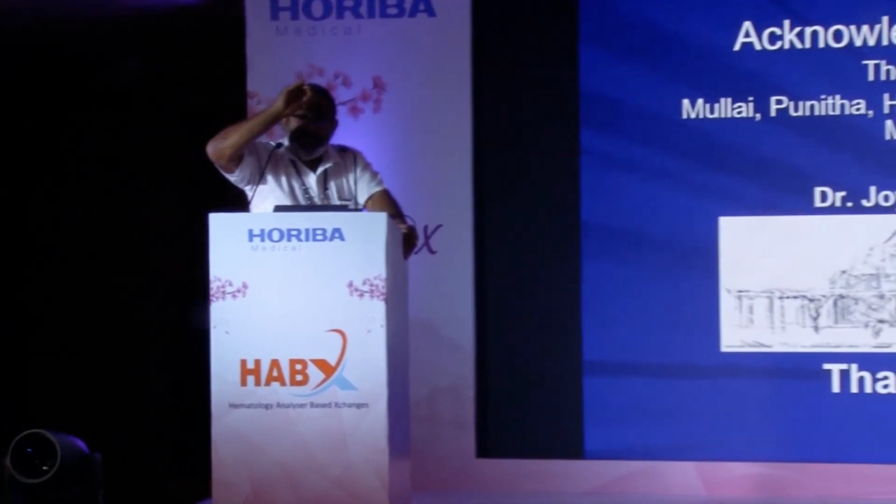Oh my God, actually, madam! I'll tell you one thing. NRBC, there's enough literature. If you are able to identify NRBCs on the peripheral smear in an ICU patient, you are predicting death. But please don't tell them.